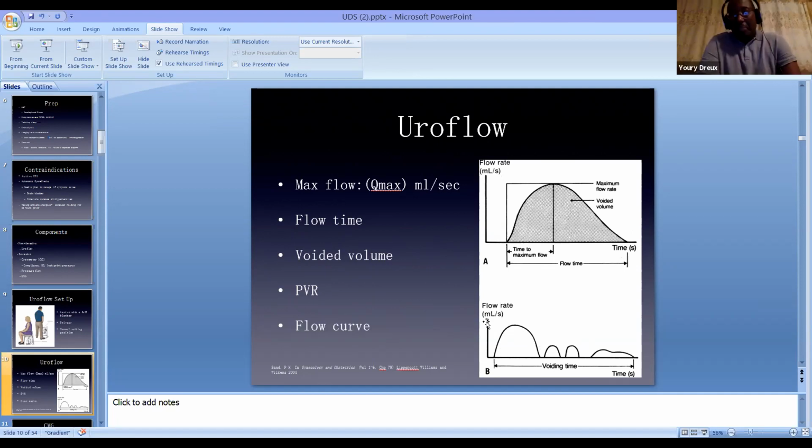Yes, sometimes we use our ears also. When you're listening to the sound, you can imagine if it's good or not. Right. This is what we do. We do what we have. That's our technique.